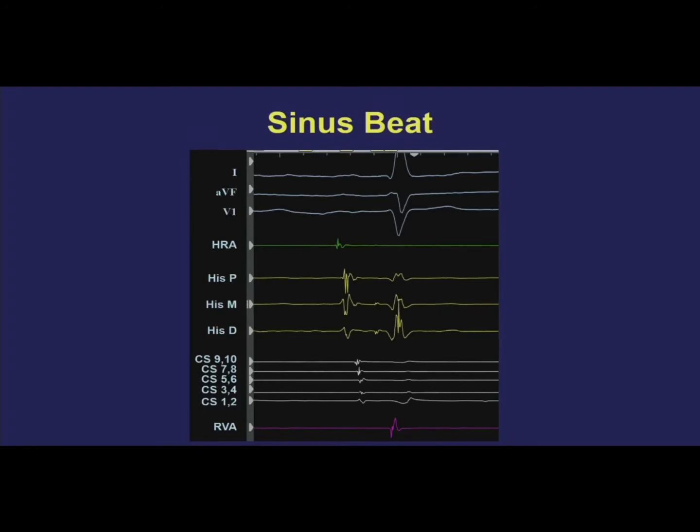This venous structure deviates toward the ventricle and away from the groove, so you start to see taller ventricular signals the further out you get. If you pushed it further out the great cardiac vein, you're going to see even bigger ventricular signals. But you know these are ventricular because they line up with the QRS.